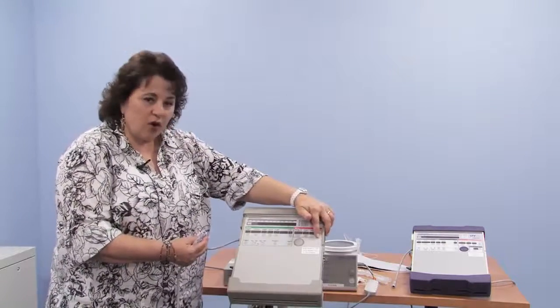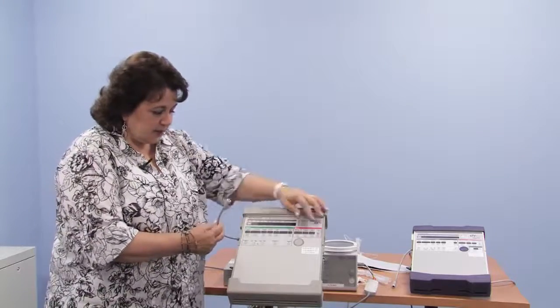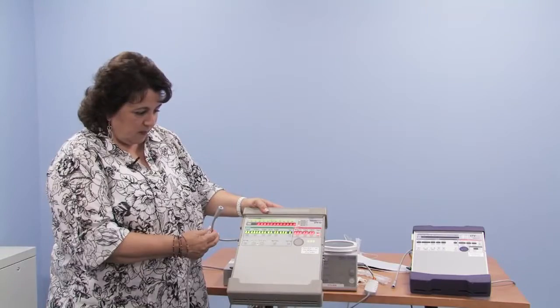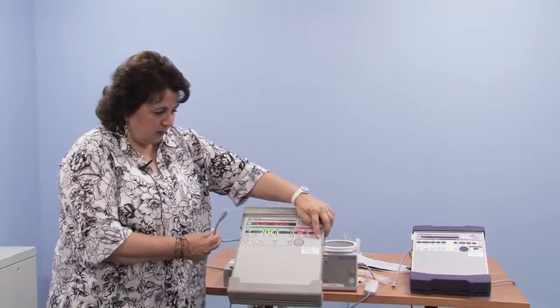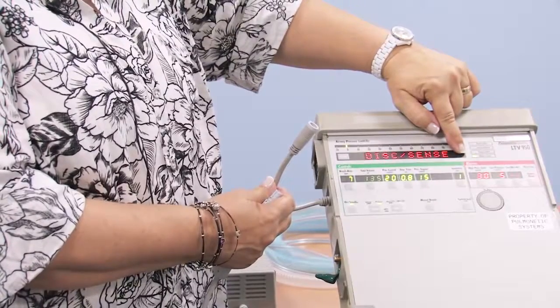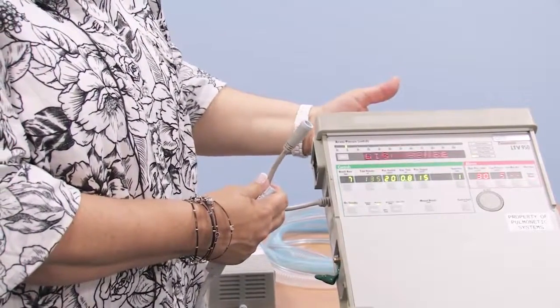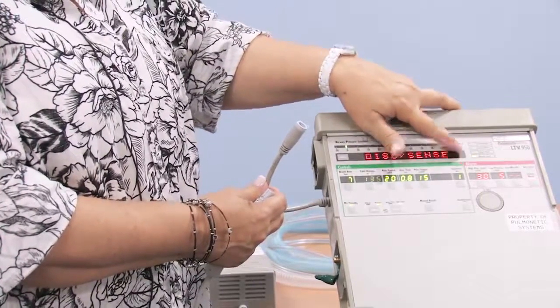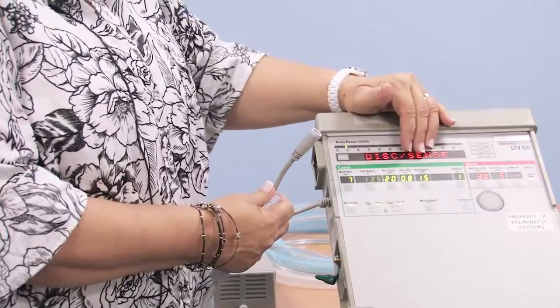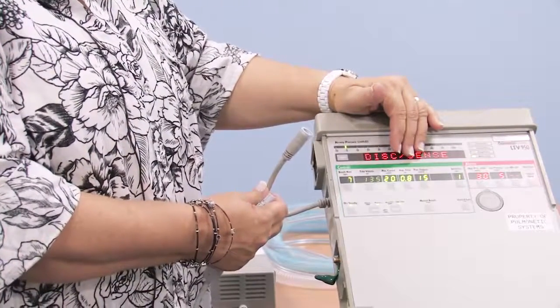If I turn the machine on right now, and the machine is not connected to any power, you will see the battery level light come on as green. So my internal battery of about 1 hour is full. This light will change to amber and to red. The machine will say bat low to warn you that that battery's low, and bat empty when it's empty.